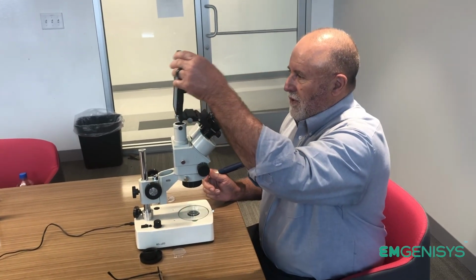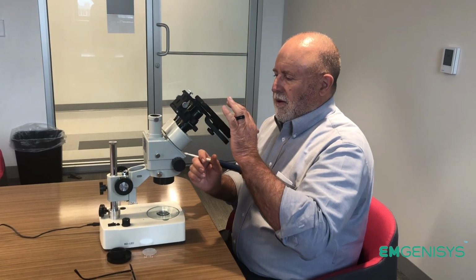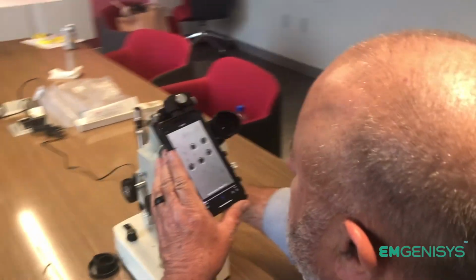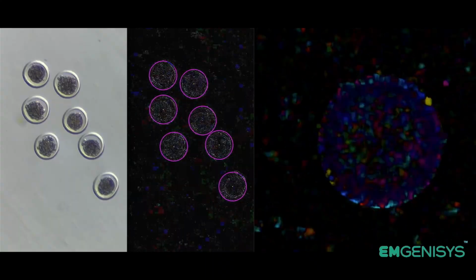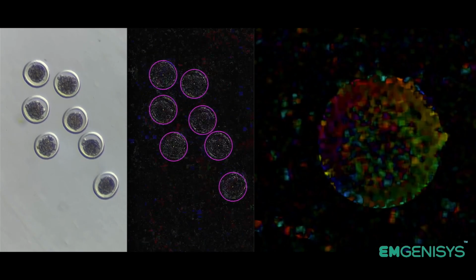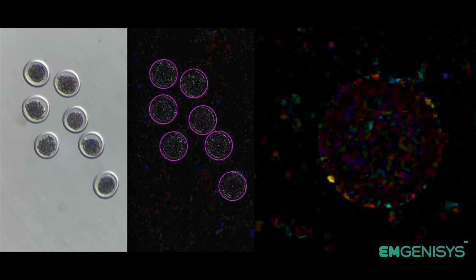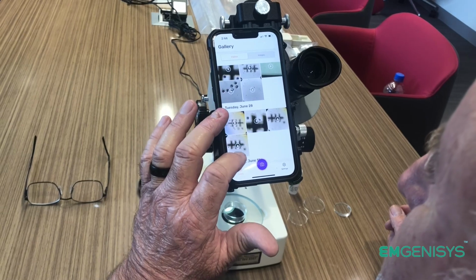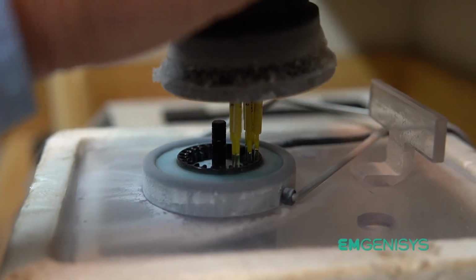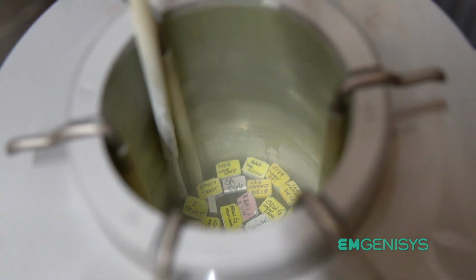While the embryos are still in their holding dish, we arrange them in a line in which the embryos are not touching or superimposed. We then use our smartphone to record a 30-second video of the embryos and upload the video into our web-based platform. This analysis can be performed immediately to scan each video frame by frame, measuring the embryo's real-time morphokinetic activity to provide a comprehensive evaluation of the embryo's health. Then, the veterinarian can access the reports and use this objective data to manage his breeding strategy. When the healthy embryos are identified, they can be frozen for later use or transferred immediately as fresh embryos.